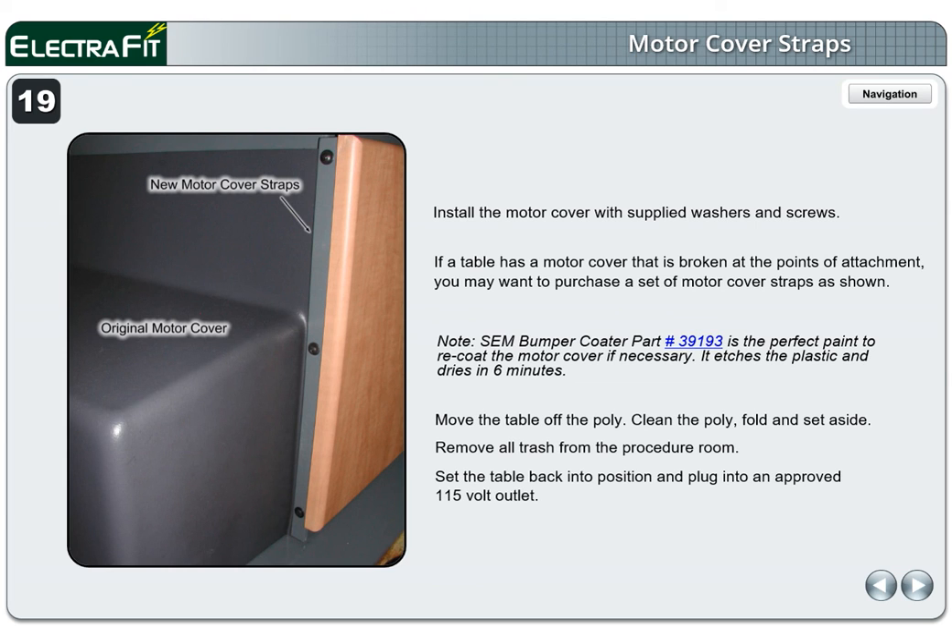Move the table off the poly, clean, fold, and set aside. Remove all trash from the procedure room. Set the table back into position and plug into an approved 115-volt outlet. Perform leakage current tests.